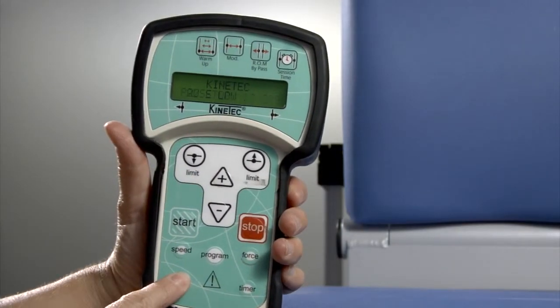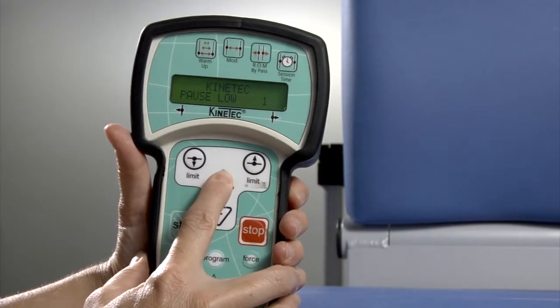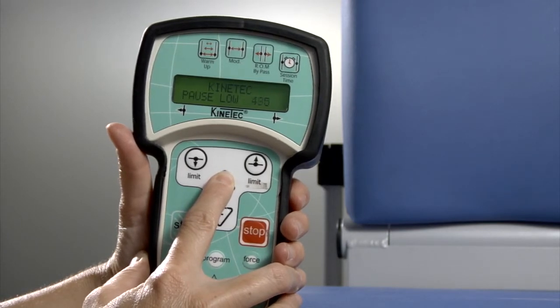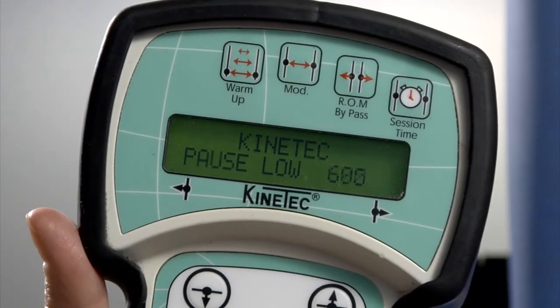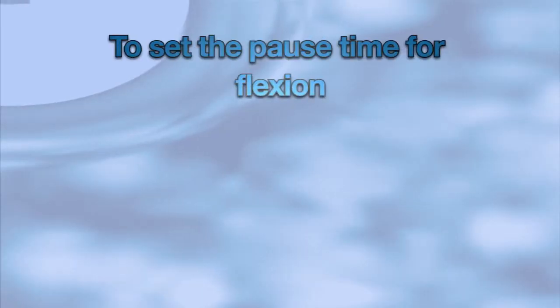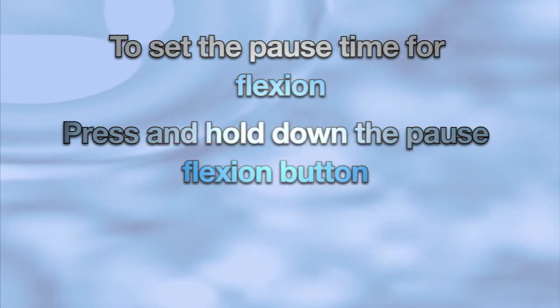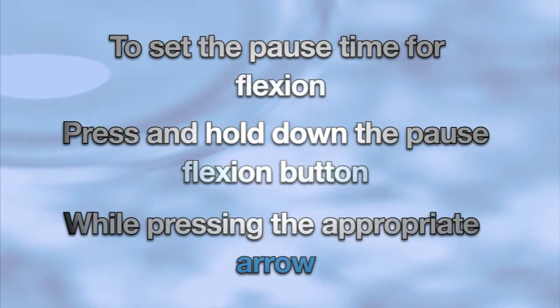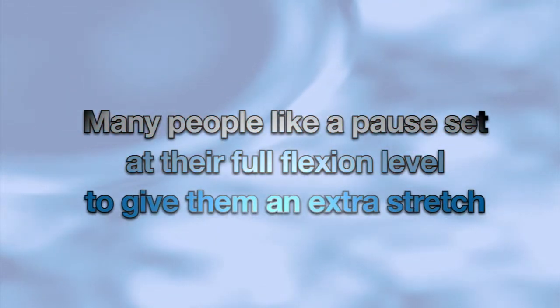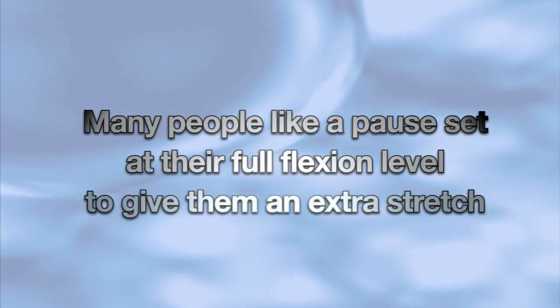To set the pause time for the extension, press and hold the pause extension button down while pressing the appropriate arrow. The pause time can be set anywhere from 0 seconds up to 2 minutes. To set the pause time for flexion, press and hold down the pause flexion button while pressing the appropriate arrow. Many patients like to set a pause time at their flexion limit because it gives them a little extra stretch.